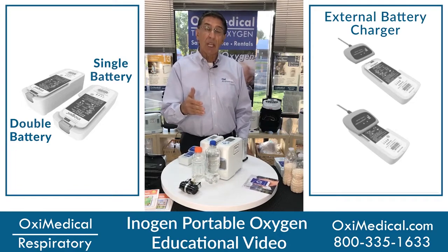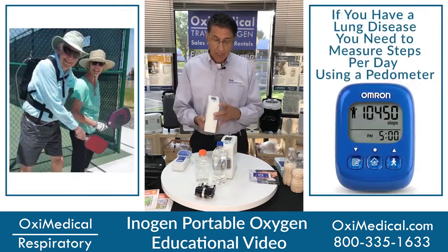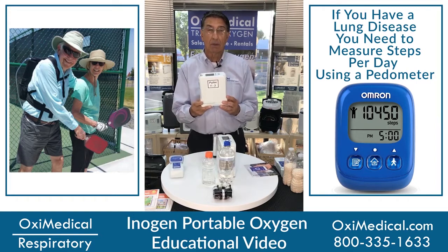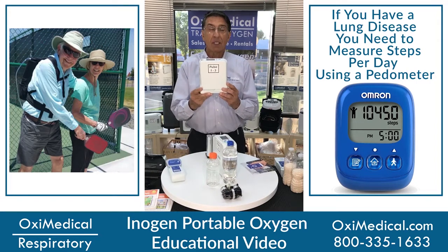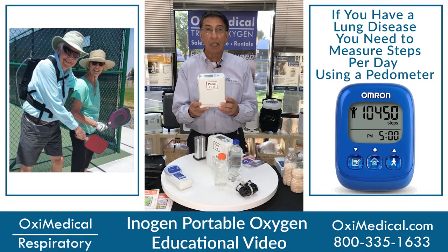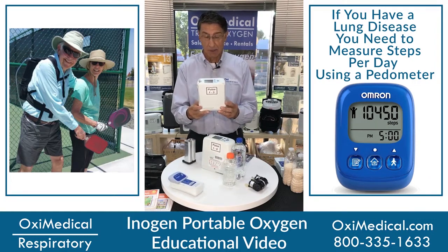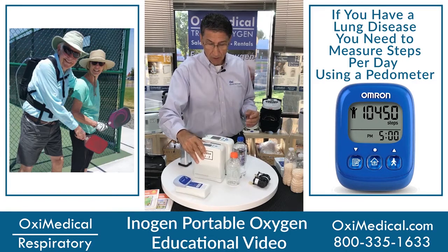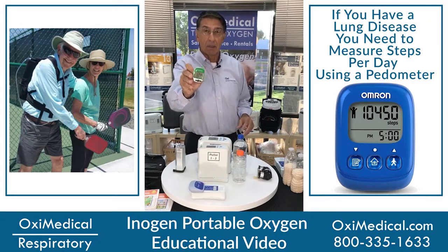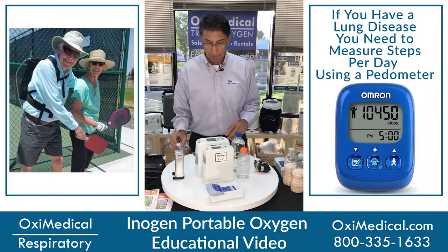Why would you get the Inogen G4 over the G5? Think of the Inogen as your exercise machine. If it's small, handy, lightweight, easy to use, you're going to get in the exercise you need, especially if you have a lung disease. You need to measure the amount of steps you take every day using a pedometer or a Fitbit, or you can set your phone to count your steps.